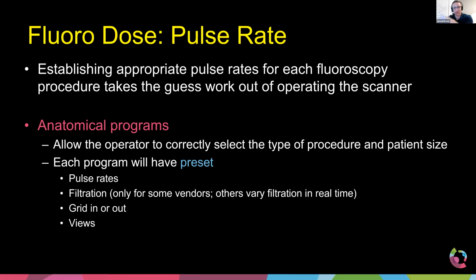So when you get back to the reading room, if you're doing it in person, you can read through and get your diagnostic. Or if you're in the reading room, when the procedure hits your work list, you know that all of the imaging coming across will provide the information you need to make your diagnosis.